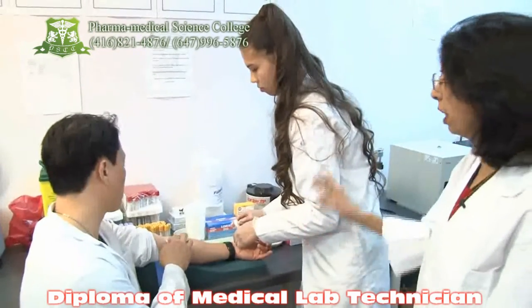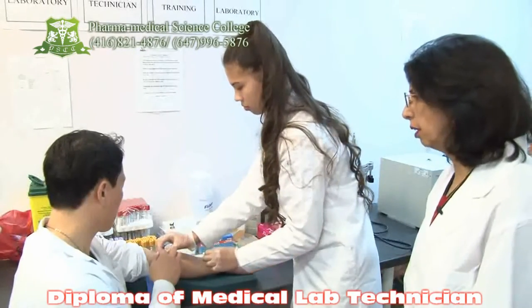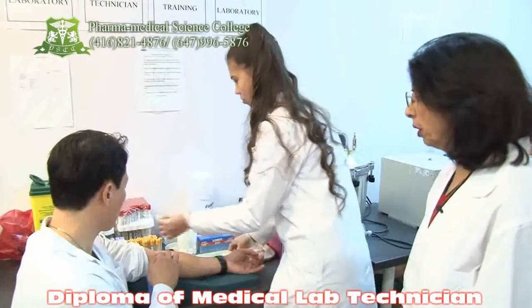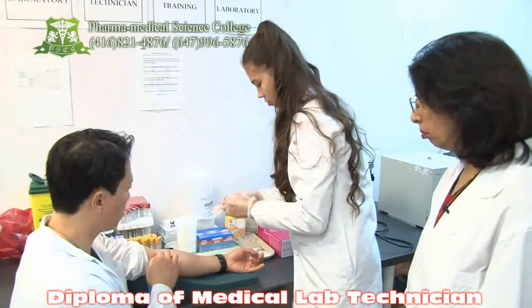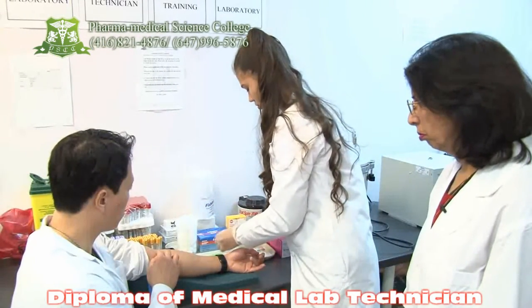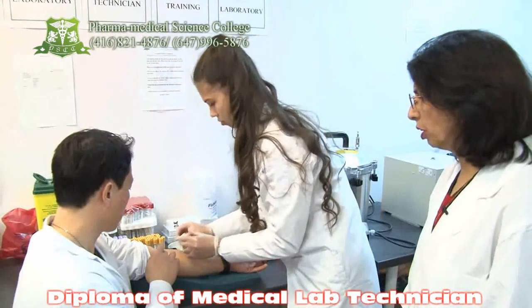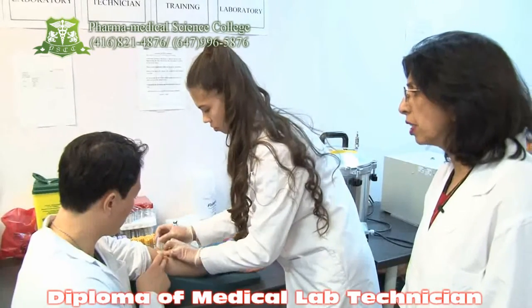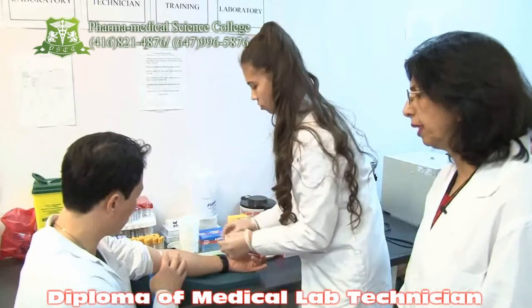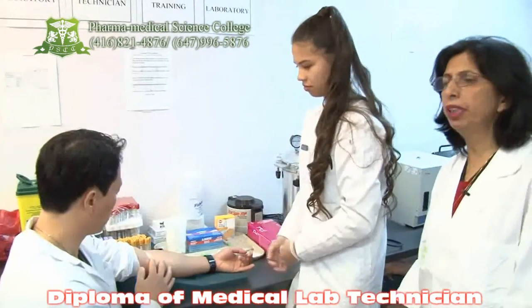If it is fine, then she will put the bandage on it. Very good. Excellent. Hold it tight, please. Put the bandage. And ask the patient to press on the side tightly. Please keep it pressed. Thank you very much. The act of phlebotomy is done.